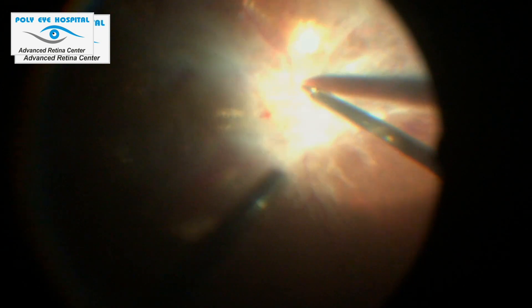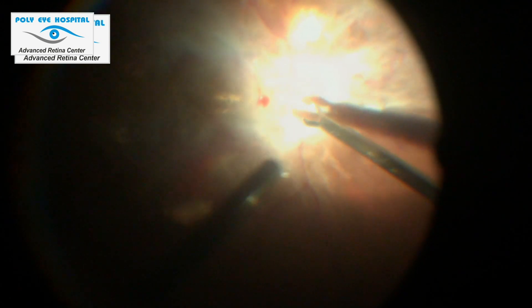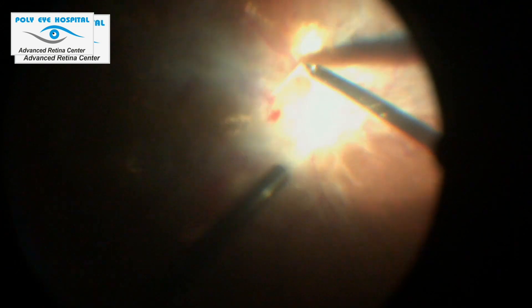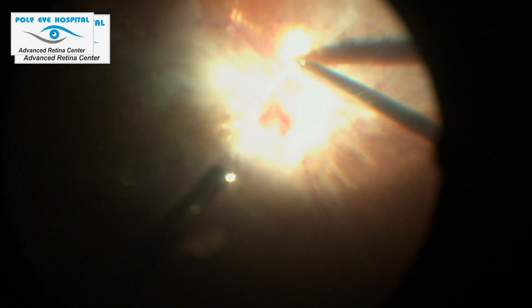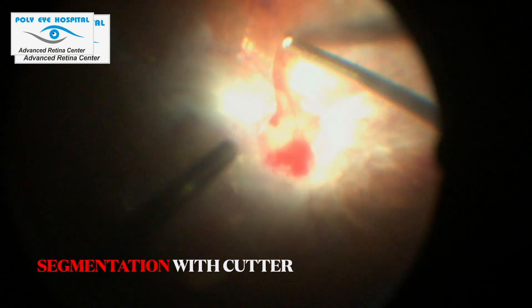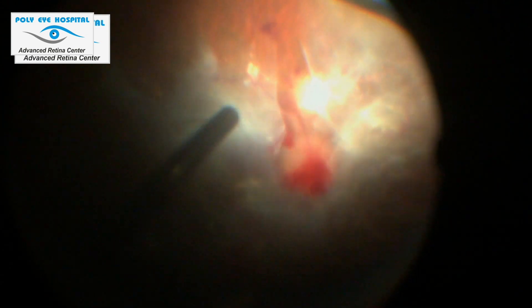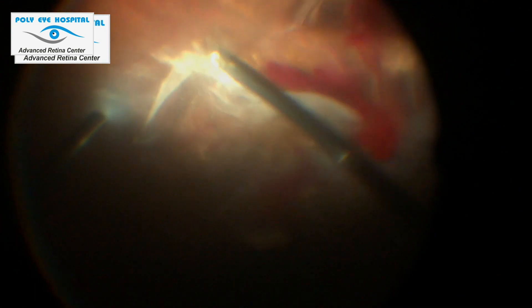The second type of diabetic case is where all membranes are tightly stuck to the retina along with the hyaloid. Here, forceps are used to lift the membranes from the disc. A sort of rent is made in the hyaloid and a plane is formed, and further dissection is carried out using the cutter. The advantage of lifting PVD from the disc is that we always get the exact plane of dissection, as secondary membranes also get lifted along with the hyaloid.